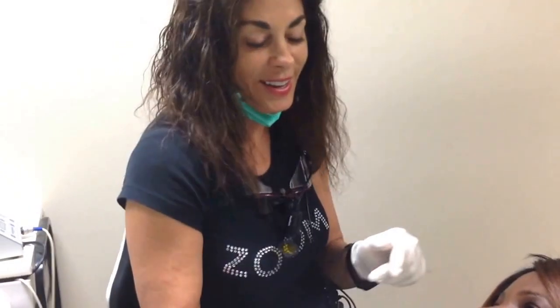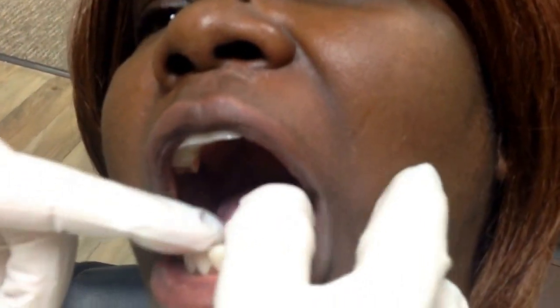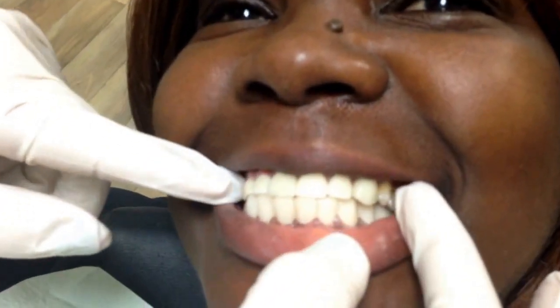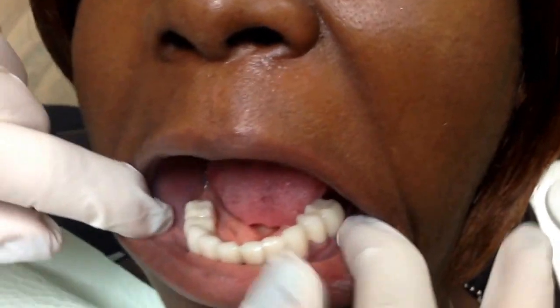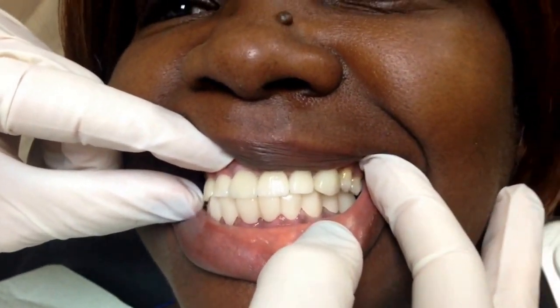So we're going to go ahead and try it in — we're going to need a mirror. Are you excited? I am. Let's go ahead and open for me. Let's zoom in. It's going to snap in, snap in, and snap in. And it fits pretty snug, correct? Yes. Bite down for me on your back teeth. Smile really big. Go ahead and open big — you can see she now has a full mouth of lower teeth. It fits perfectly along the gum line. Bite down. It's the exact same color as her upper teeth.